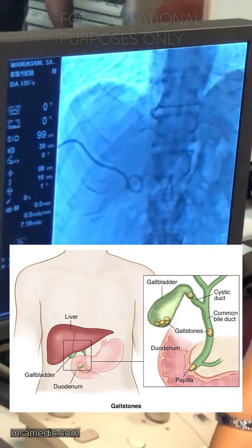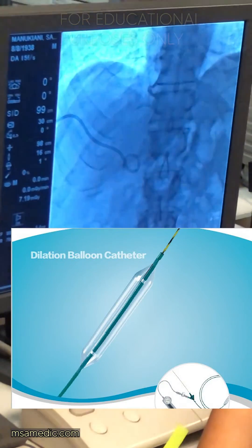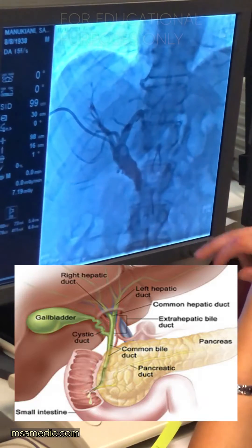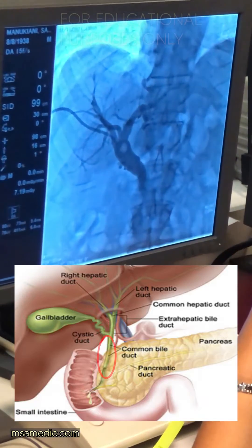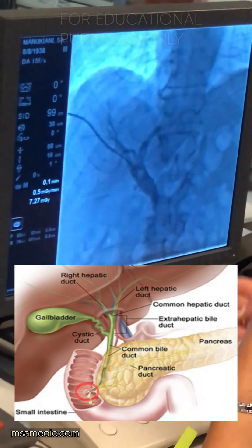The radiologist inserts a balloon dilator through the sheath and they will try to push the stone down the common bile duct into the duodenum.